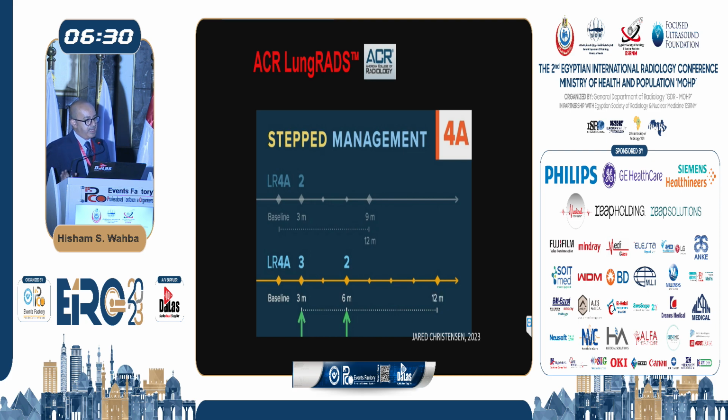And nowadays, I believe we should use Lung-RADS in lung cancer screening. It shouldn't be used in every single CT chest report because it's too much calling for lung nodules, too much calling of data for no reason. Again, Lung-RADS should be used just for lung cancer screening.